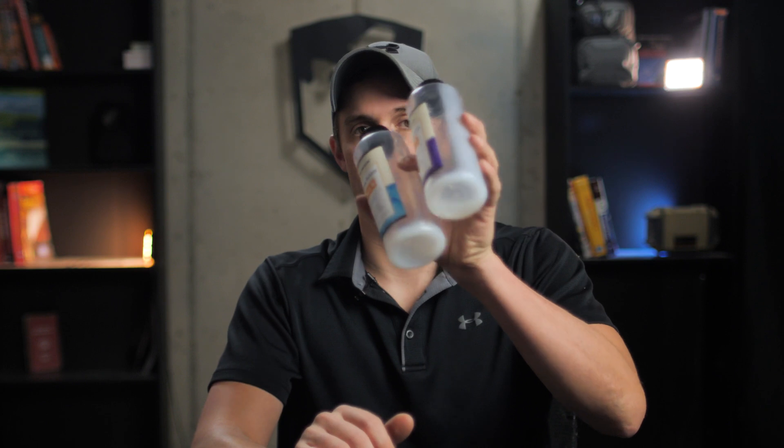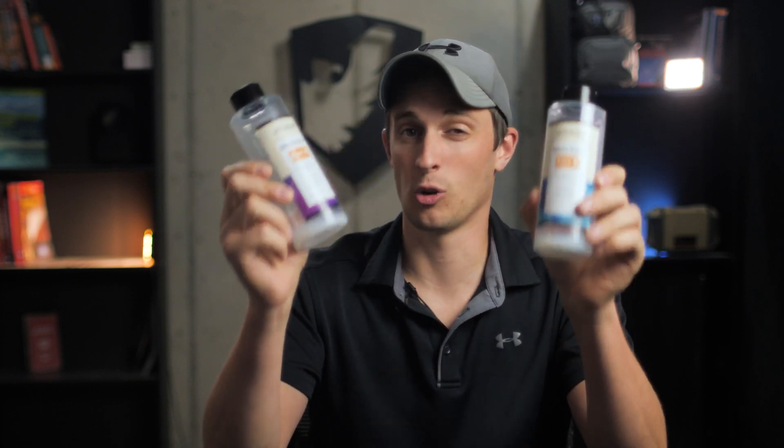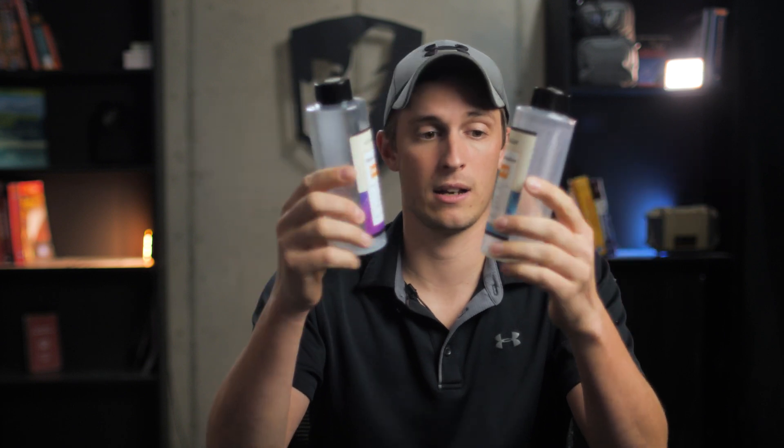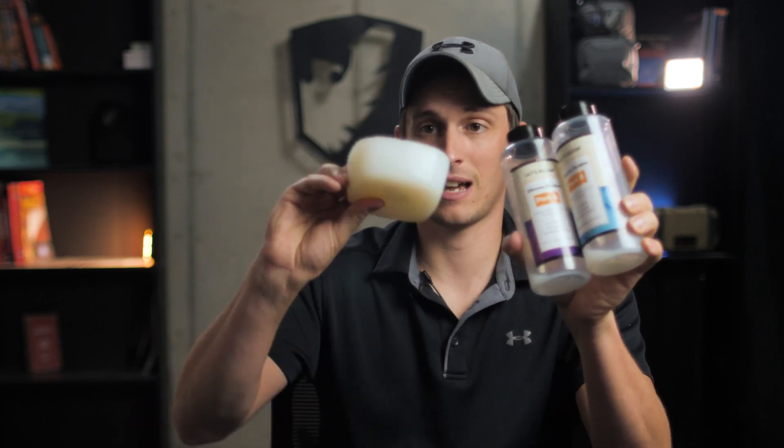We're going to take you step by step and show you where to acquire the supplies and then how to make your own silicone bleeding control or wound packing props. First off, you're going to need a two-part silicone. We got this from Let's Resin — they have supplies for making silicone molds and a bunch of other stuff. The silicone itself is two-part: mix it together and stir it. It's one of the better options as far as price goes. I think we paid $30 to $35 for this set, and you can get two props this size out of it.